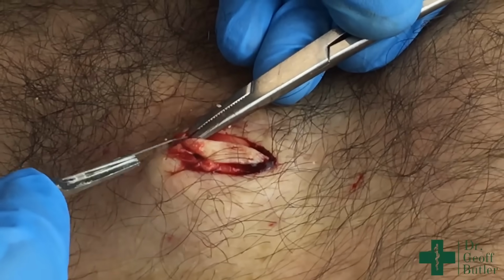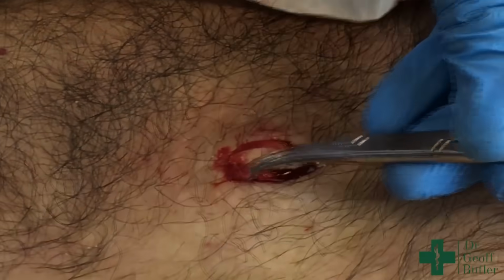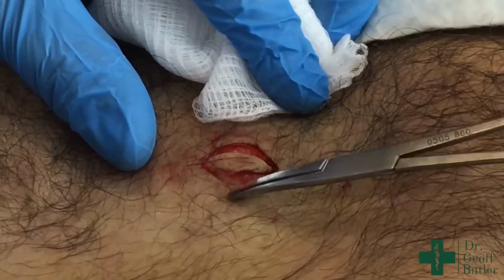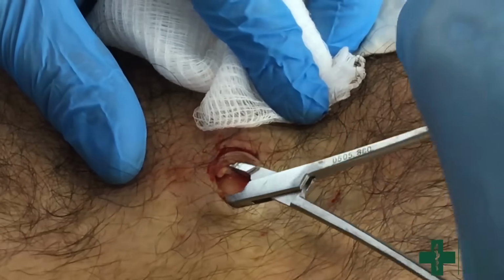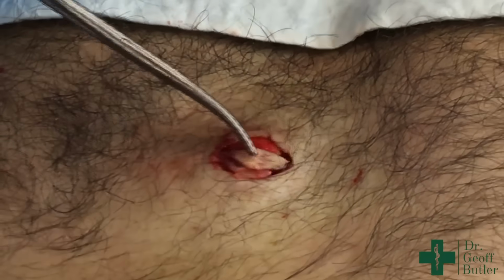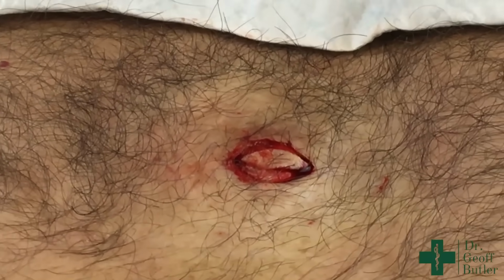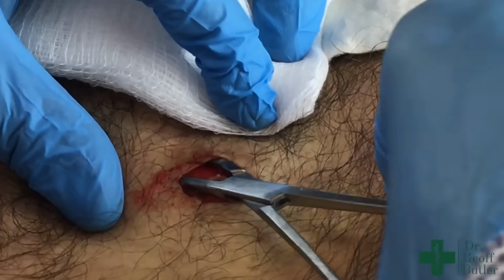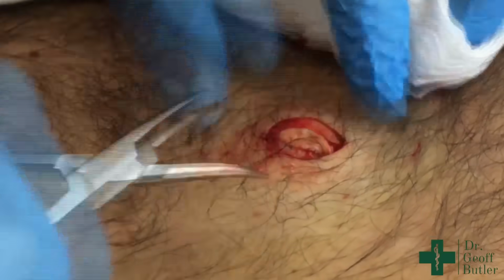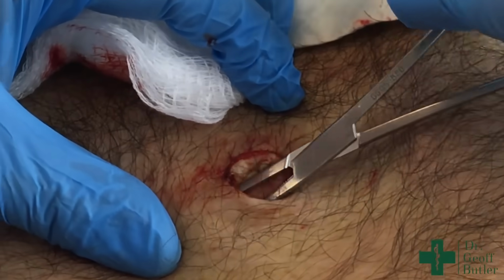So you can see here, sometimes the tissue is a little bit more difficult to get through than you'd think. These are all brand new scalpels, obviously the blades. Just need a little bit of a sharp dissection of the base. Just like you've seen me before, what we're trying to do here is break down as many adhesions as we can. And then we'll see how much of this we can just get to pop out for us.